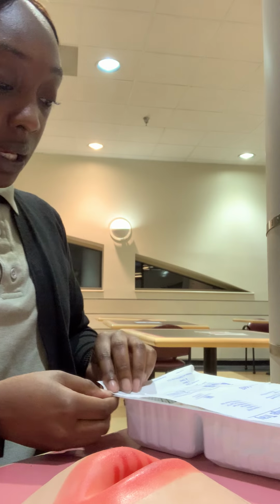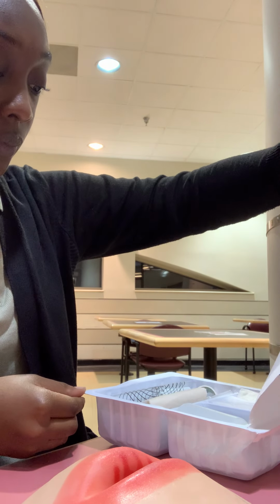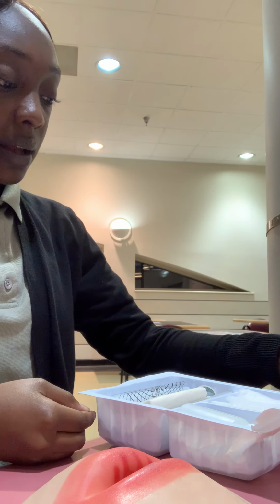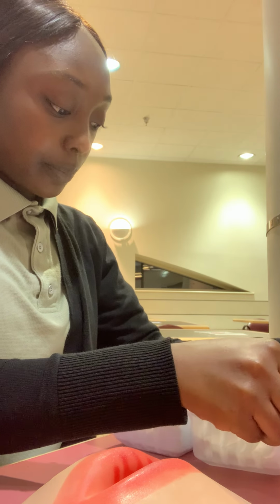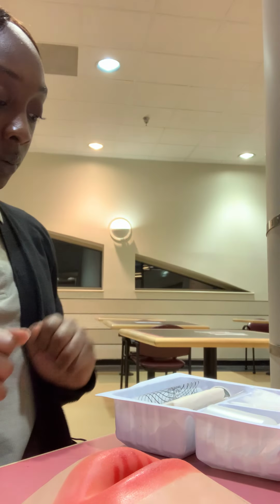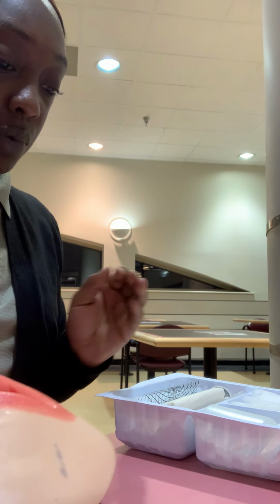I am opening my package away from my body. The top is laying on the floor, okay? I have to move my wound over.